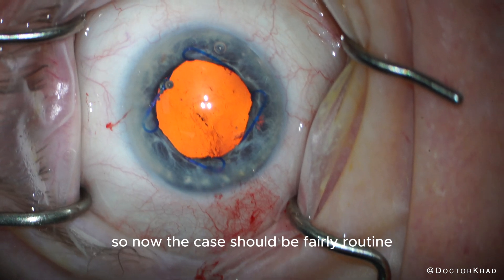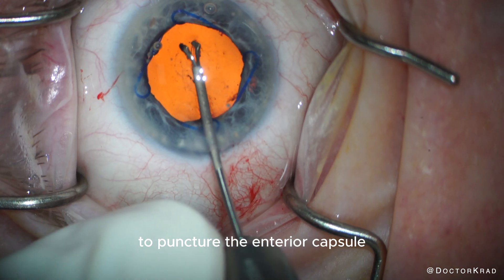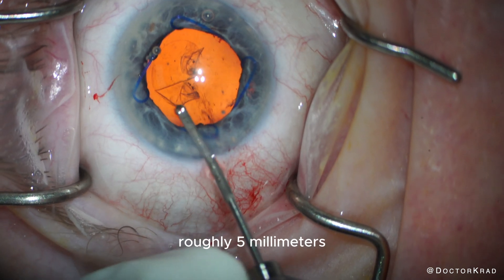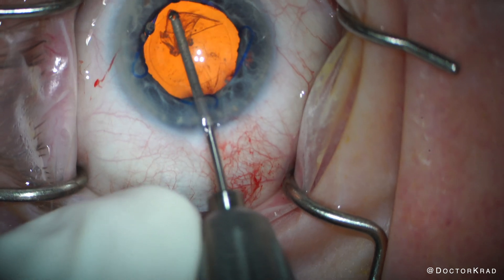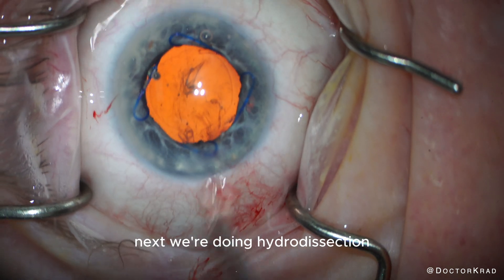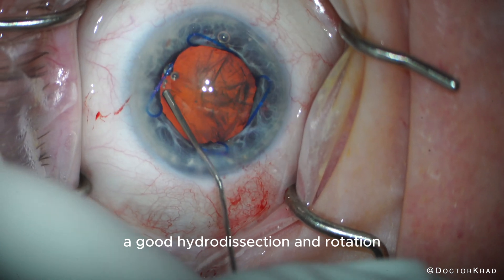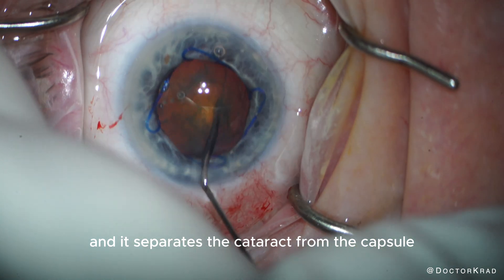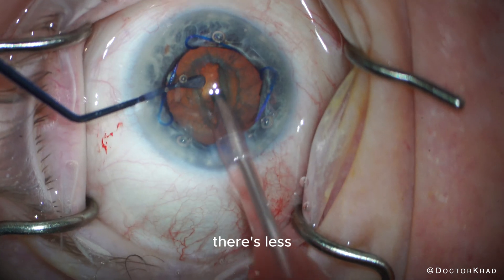So now the case should be fairly routine. I use a sharp tip MST capsulorhexis forcep to puncture the anterior capsule and perform a capsulorhexis of roughly 5 millimeters. This Malyugin ring has a 6.25 millimeter diameter, so I can use that for reference. It looks like the zonules are good — I don't see any unusual folds in the capsule. Next, we're doing hydrodissection, where we separate the cataract from the capsule using balanced salt solution. A good hydrodissection and rotation makes the rest of the case so much easier, and it reduces the transfer of energy to the capsule and zonules when you're manipulating the cataract.